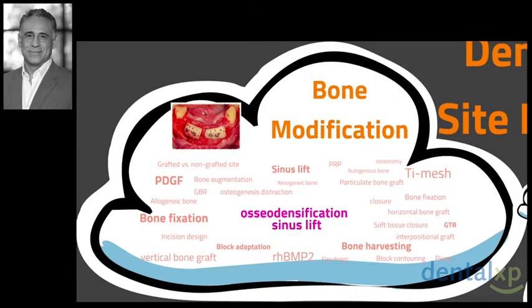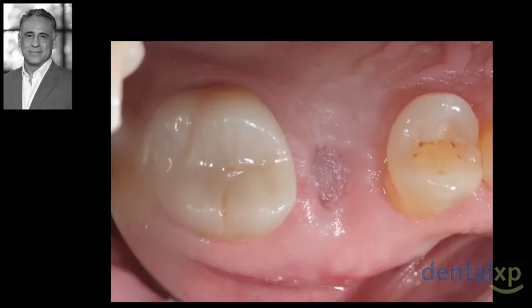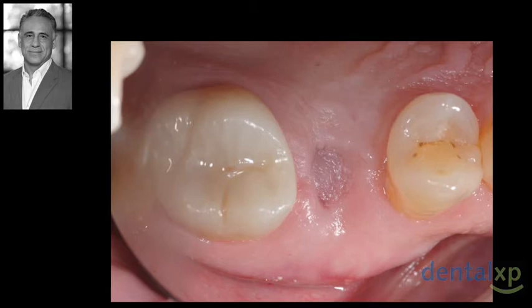With so many bone modification techniques and tools that are available, today I would like to discuss the combination of osteodensification and internal sinus lift techniques in a patient planned for implant replacement of his upper first molar, and demonstrate how we can develop our implant site to achieve more predictable results.